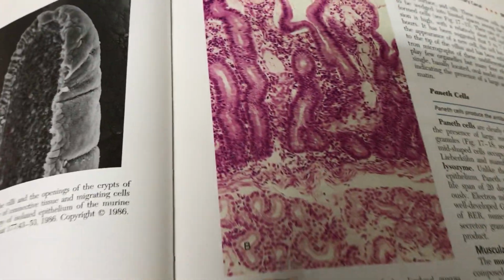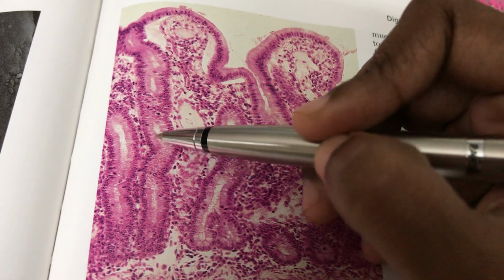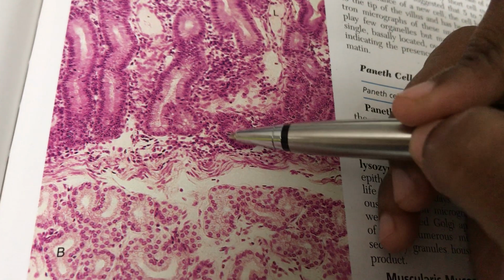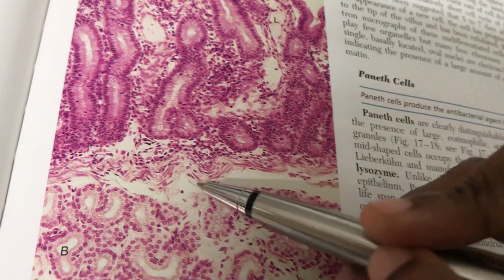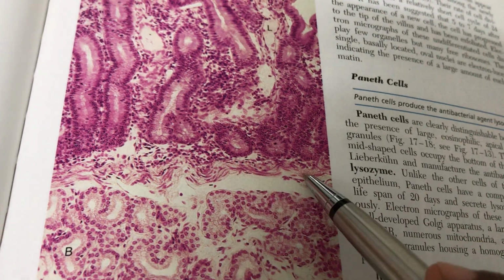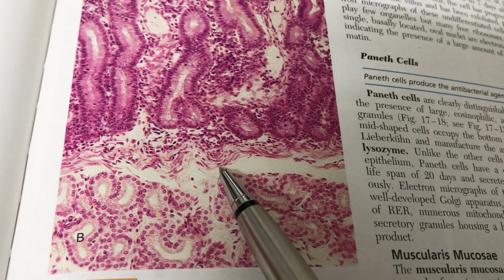So we'll see. Look at this. This is a very important spotter. That is your duodenum. You can see the villus is going up and it is coming down and forms the crypts of Lieberkühn. Can you see this? This is the crypts of Lieberkühn. Understood? These are intestinal glands. Now you can see it is present in the lamina propria, and the next layer is the submucosa. Here and all you will be having inner circular and outer longitudinal, except in the esophagus only, where I said only the longitudinal layer is present.